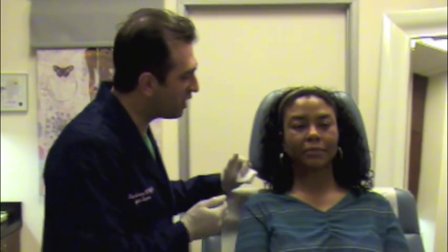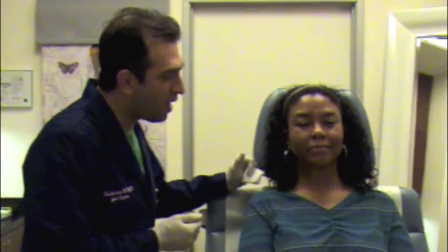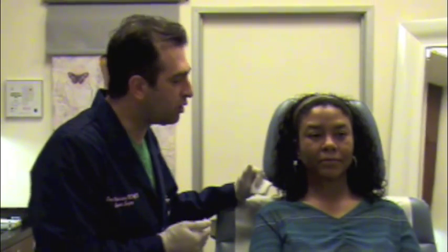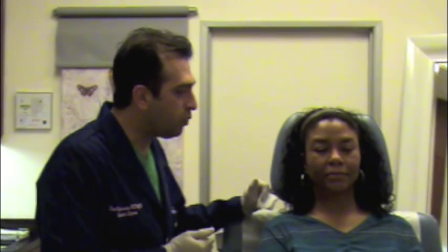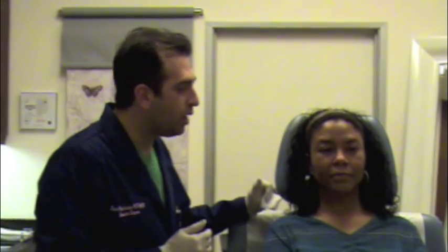Hello, I'm Dr. Mashhadian. I'm a cosmetic surgeon here in Rodeo Drive, Beverly Hills, and I have the pleasure of taking care of Lynn today. Lynn has been experiencing some Bell's palsy on the right side of her face for the past few years, and today she's given me the privilege of taking care of her. We're going to do some mask camouflaging so that she obtains some symmetry.